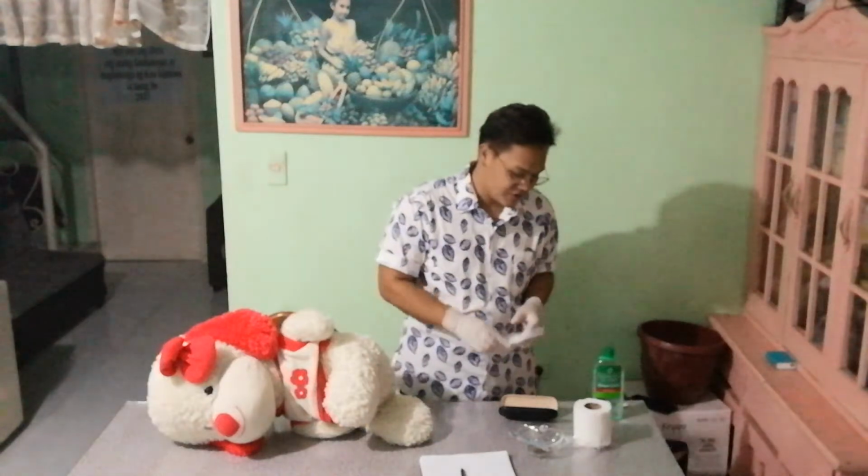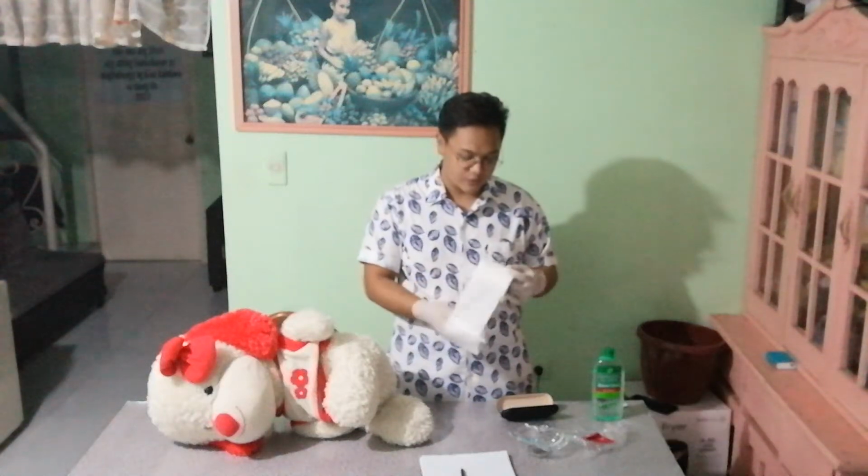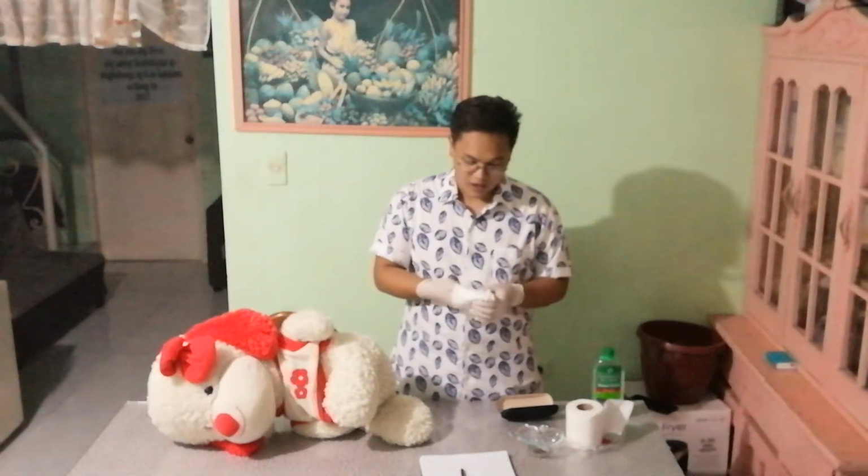So for our 9th step, using a toilet tissue or toilet paper, we need to wipe the anus of the patient for feces and for the excess lubricant.